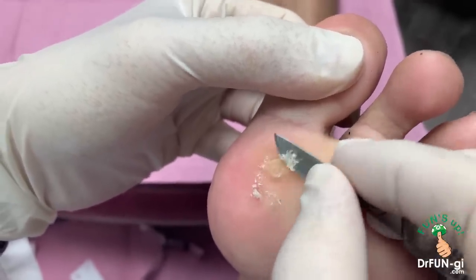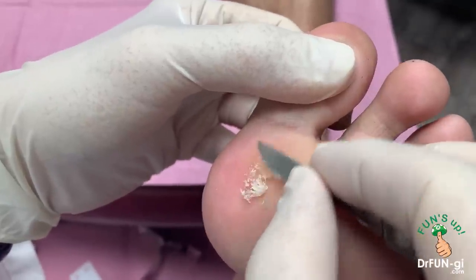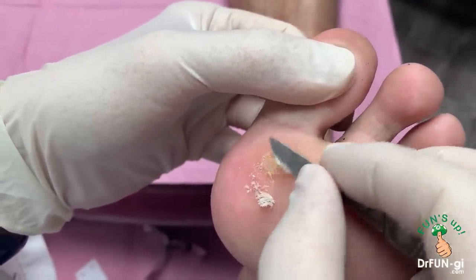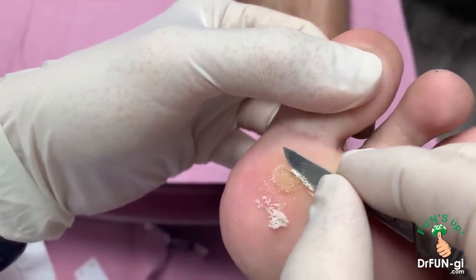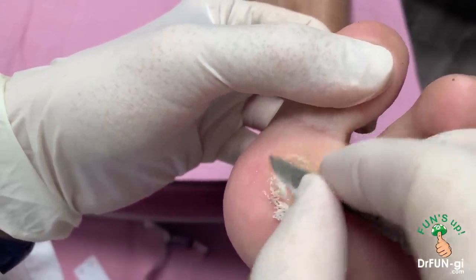And then we're going to put very strong acid here, which is very effective to get rid of this problem as well. So I'm just cleaning out the callus around it. It can be bleeding here soon because warts are very bloody. So we're just cleaning it out right now so the laser can penetrate into this area.